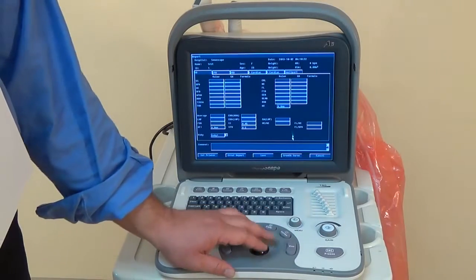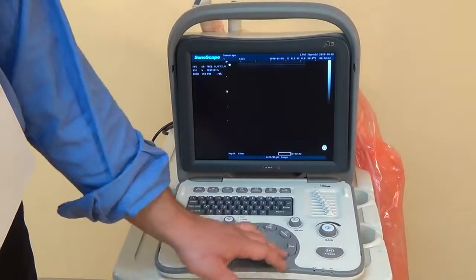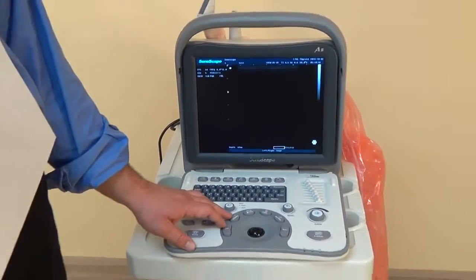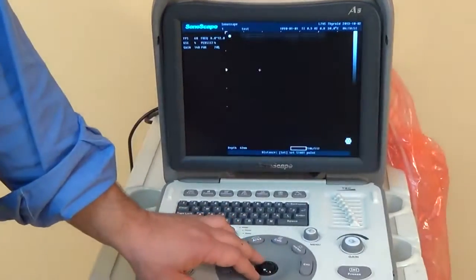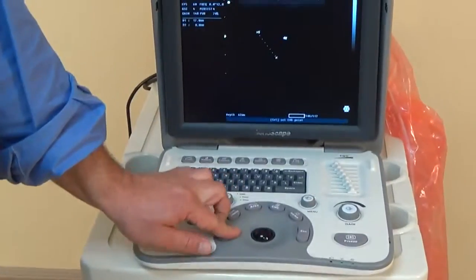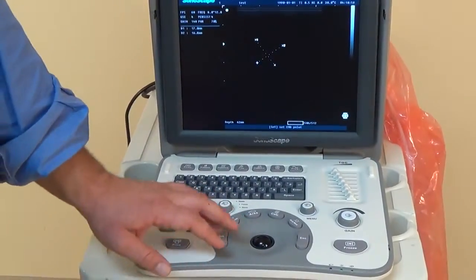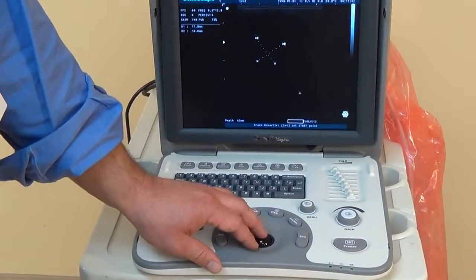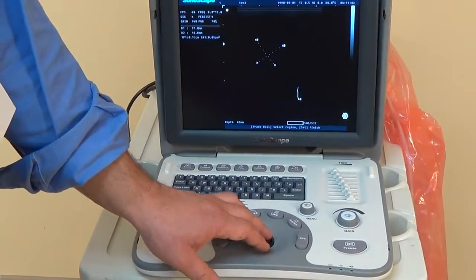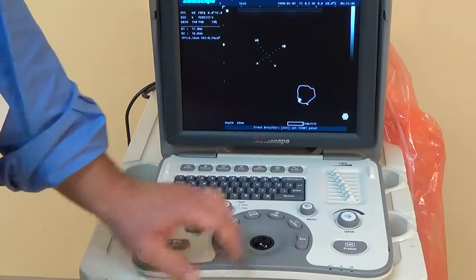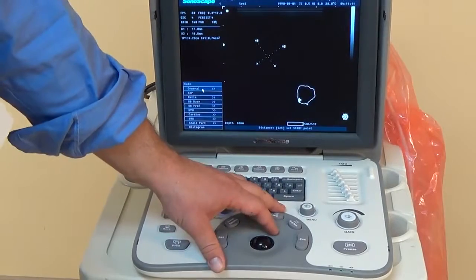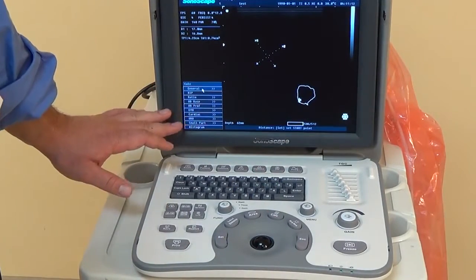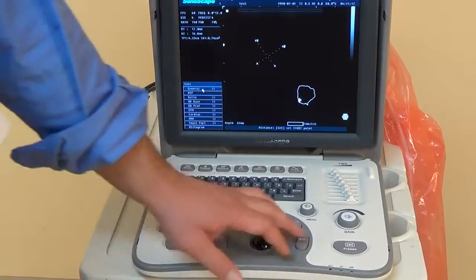Let's get out of that. And then you have your basic user function keys. So distance is another popular one that's kind of self-explanatory. You hit the button, set one point, go to the next, and you can continue doing that indefinitely. And then all your measurements come up on the side, so that's good to know. Area button is if you're measuring something a little more in detail, you just draw your circle or your square or whatever the case is that you're trying to measure, and you get your area.